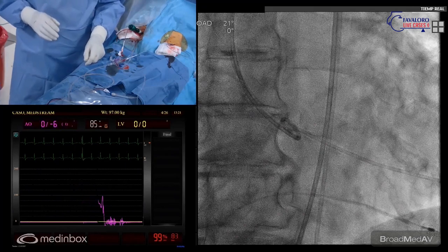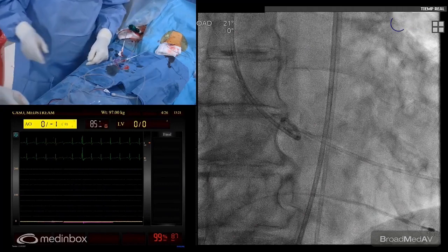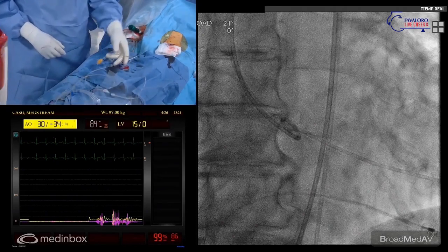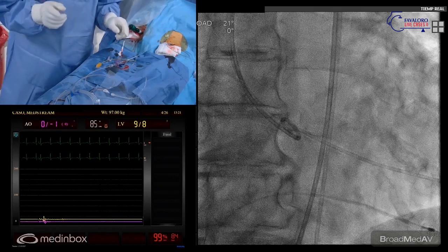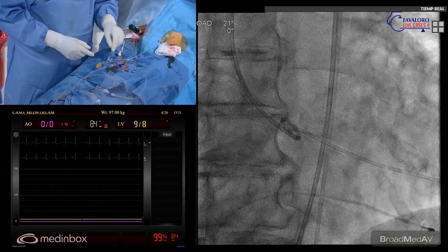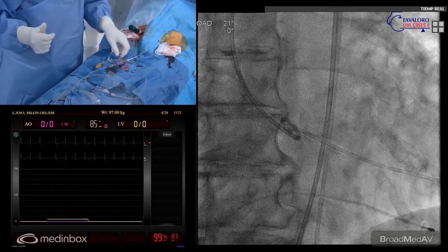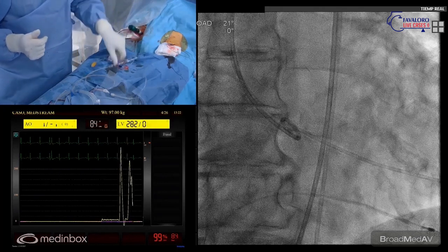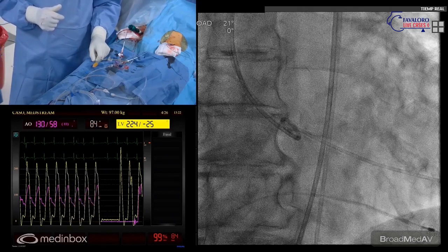How do you select patients for same day discharge? Well, it was only a very short experience of six cases up to today. But I was talking with people from the US, in some hospitals in Dallas, and they are discharging 20% of cases the same day. So I am more motivated. First of all, it should be a balloon expandable valve, or maybe a patient that has a pacemaker from before. The patient should not have any electrical abnormalities and should have a very good follow-up. Very nice curves of the hemodynamics.